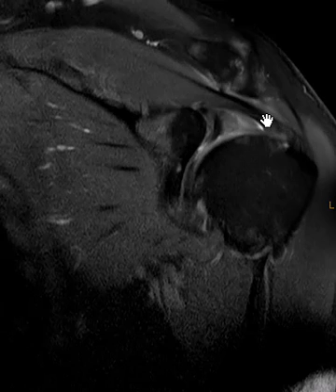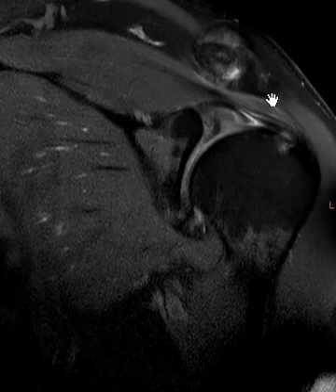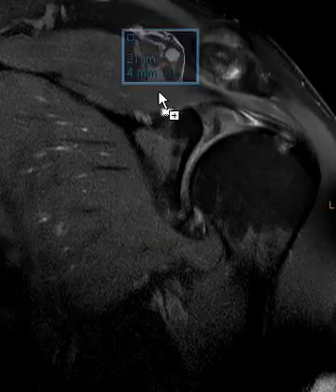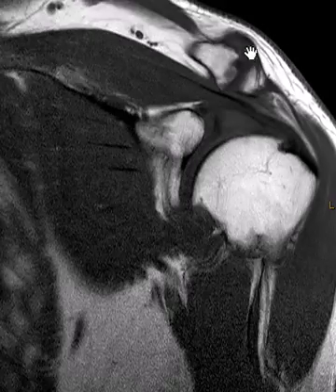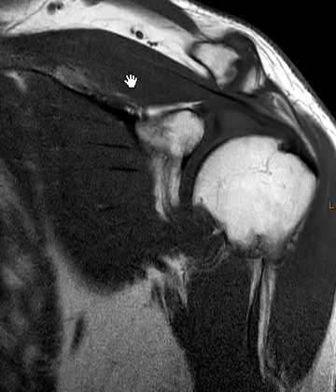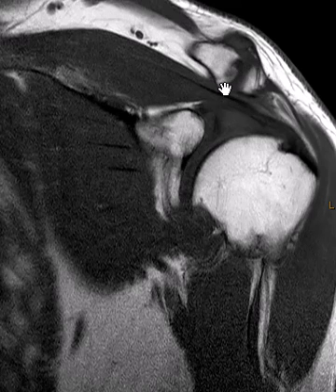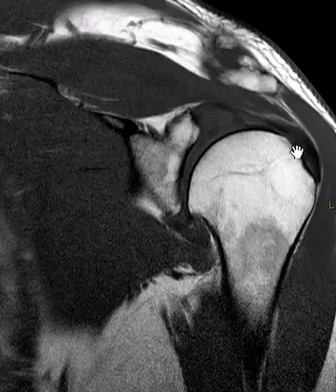This is a 61-year-old male with shoulder pain, no history of injury. They have a lot of regular findings — number one, they have a large AC joint with severe AC arthropathy. You can see the spur pushes down on the supraspinatus; here's the muscle, there's the central tendon. You can see that spur poke right down on the supraspinatus, so this may be associated with impingement. There's also a little bit of tendinopathy.